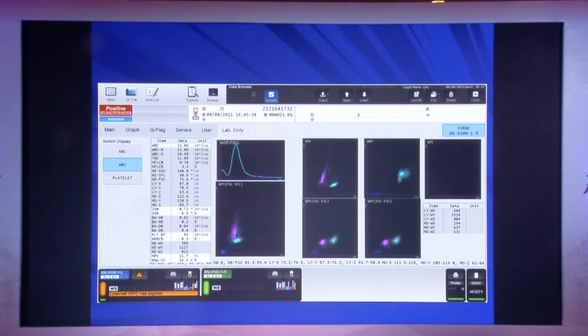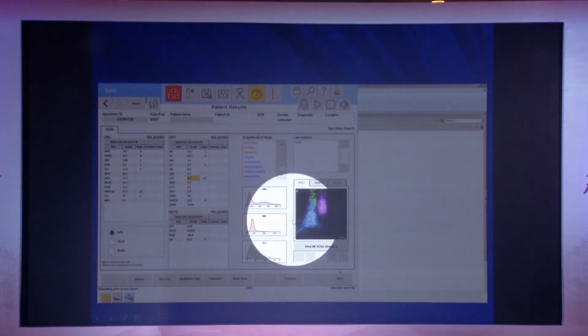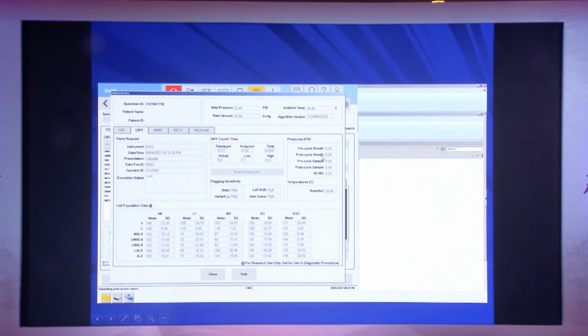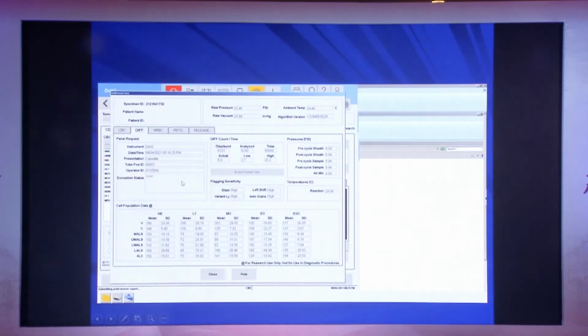This is our next, I hope Anand Vikas works on the next publication. Same here, you have the same teardrop appearance, but the neutrophils appear large. And if you look at the neutrophil data, you will see that their neutrophils are reactive.